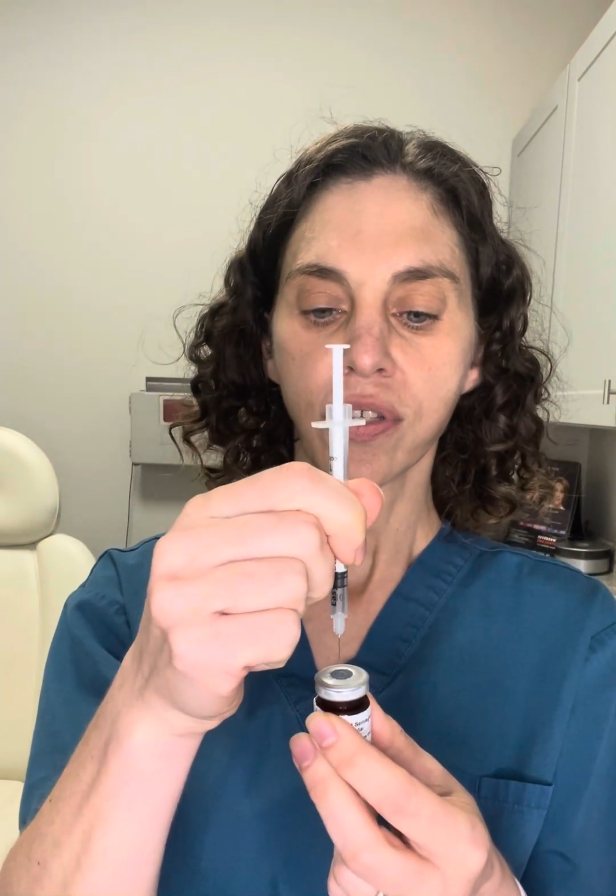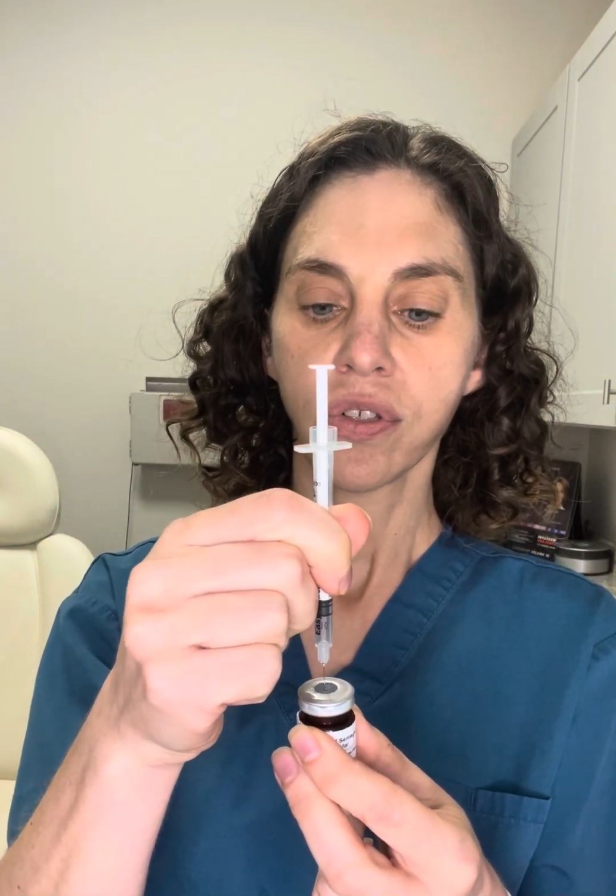Then what you do, you have your insulin syringe, needle. You also want to use a fresh alcohol prep and clean the top of the vial. When you first get the vial, it will have a little cap. You just pop that cap off and then you'll be able to do what I just did in cleaning it. So here you insert the needle straight down and you push that air in.